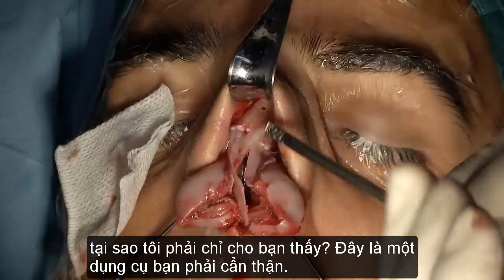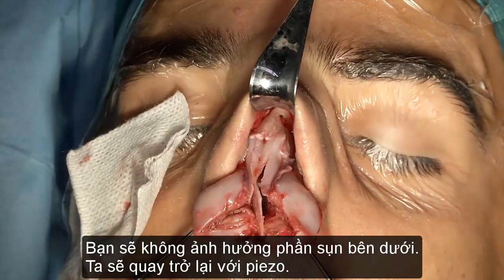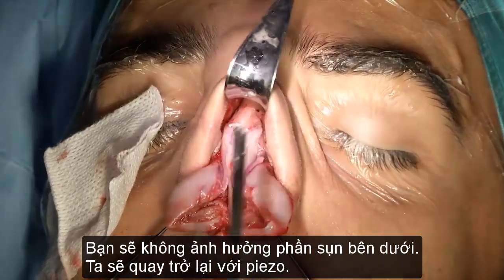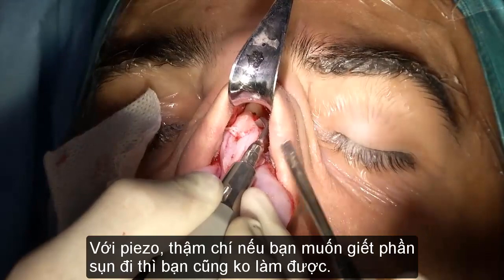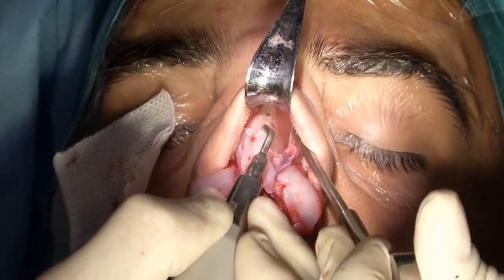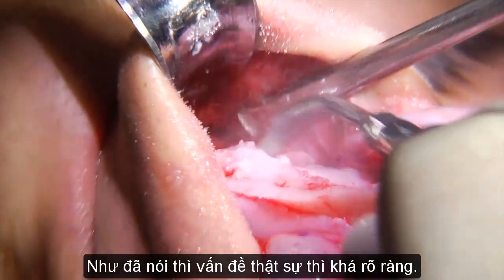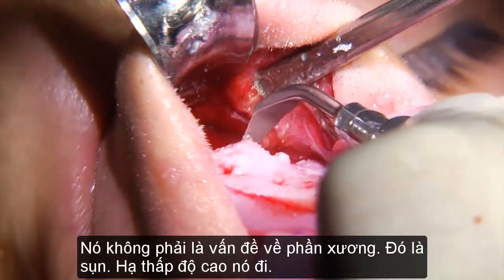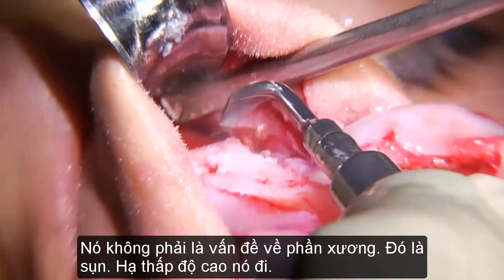So why am I showing you this? If one is careful with a power tool, you are not killing the cartilage below. So let's go back to piezo. It's the same concept. Of course, with piezo, even if you want to kill the cartilage, you won't kill the cartilage. And as you were saying, the real problem is evident. It's not a bony problem. It's this cartilage projecting out.